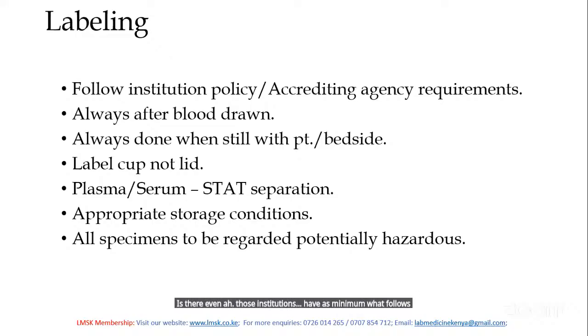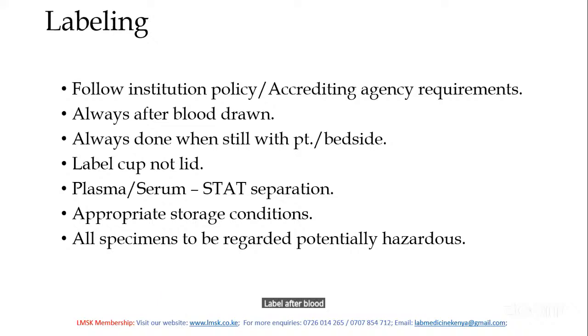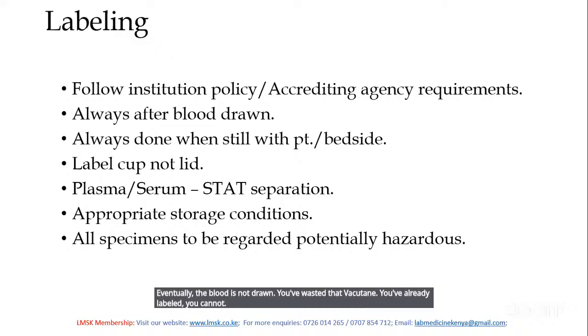One, always label after blood is drawn. Not before. There are some people who label even before they've drawn the blood. What if you miss the vein? What if eventually the blood is not drawn? You've wasted that Vacutainer. You've already labeled, and you cannot cancel and use it for another person.